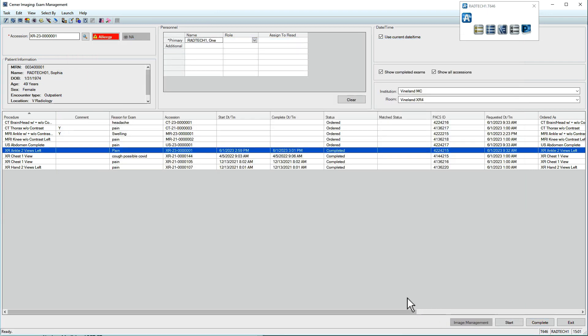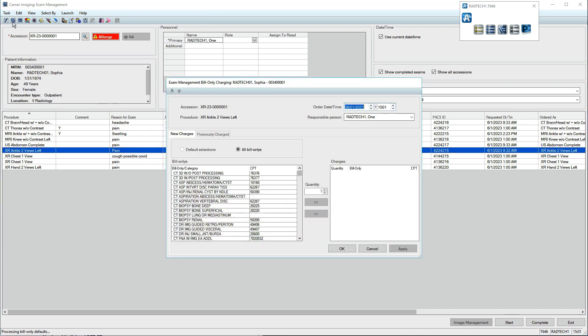To bill for services or equipment in addition to the scan, click the Bill Onlys icon in the upper left. A new window appears. Select the appropriate charge from the list, then click the right-pointing arrows.